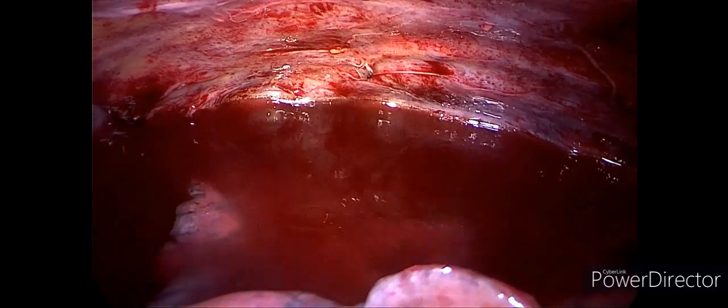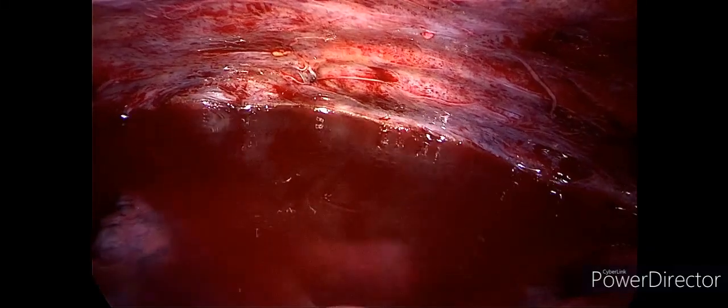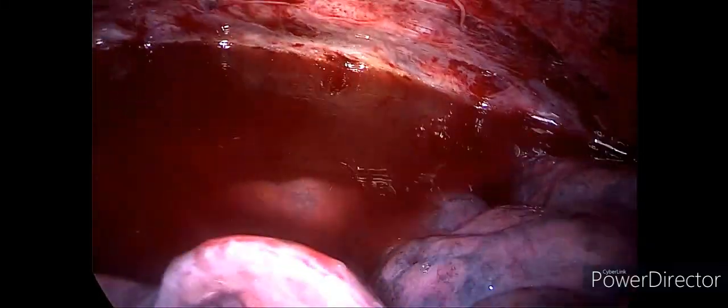I use a sponge on a stick and just immerse the lung below the fluid and check for air leak. As you can see, the lower and middle lobe expanded immediately. We're just checking the upper. It took a while for it to expand, but we're checking for air leak.